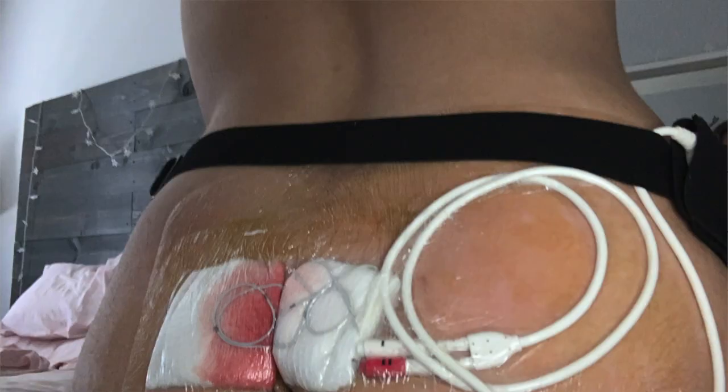It's a little off, so that one is harder to get into. And I've had this issue with hip injections in the past as well, so I wasn't surprised. But they finally got them in, they put the wires through, and I took a picture of what my back looks like right now. And I have a little belt on. It has the batteries inside, or the brain inside. I don't know what it is, but the power that sends the electricity.